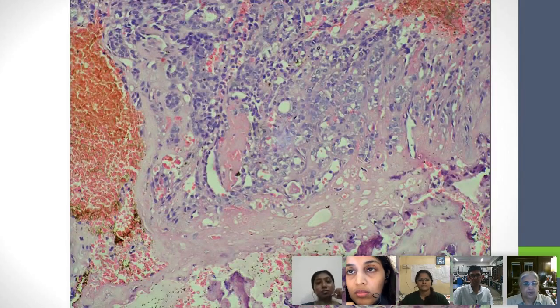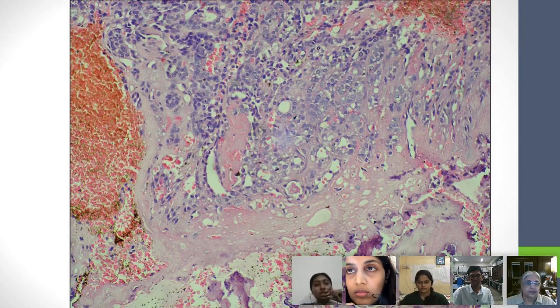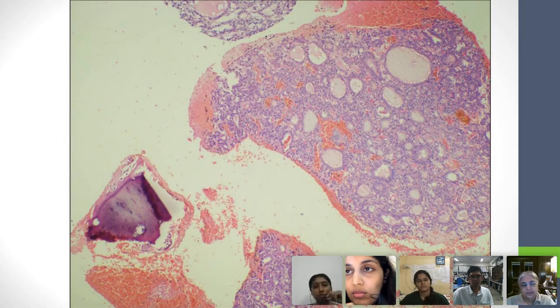Yes, come on now. So we go to the next one. Here, ma'am, these tumor cells are in a tubular pattern, and then they are infiltrating into the bony tissue, and there are areas of hemorrhage as well. All right. So what pattern did you say that you saw in this? Tubular or a duct-like pattern. Everybody agrees that this is a tubular or a duct-like pattern?